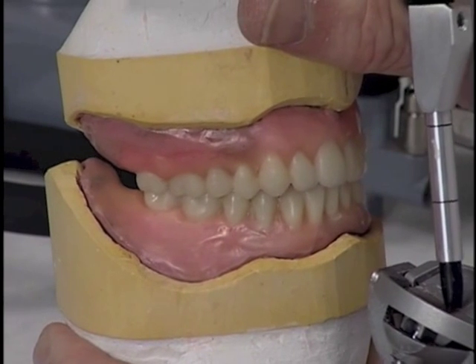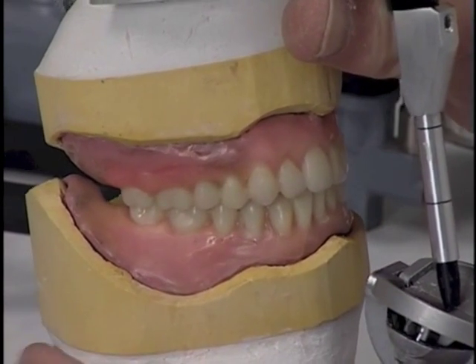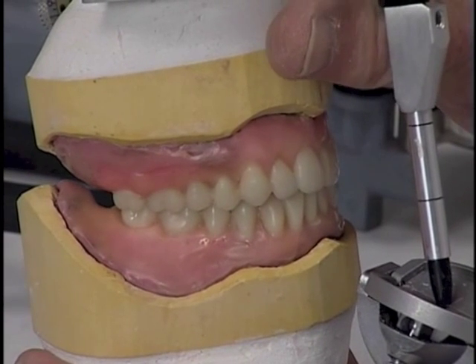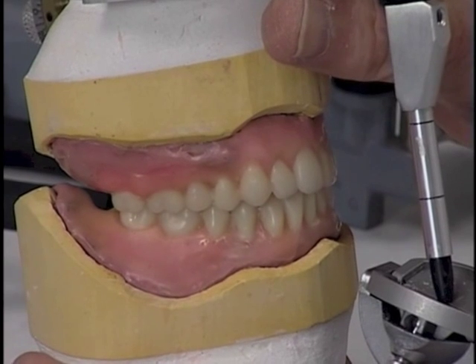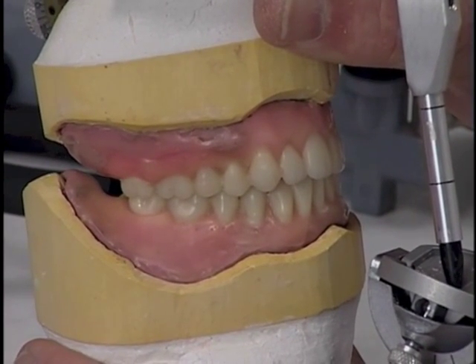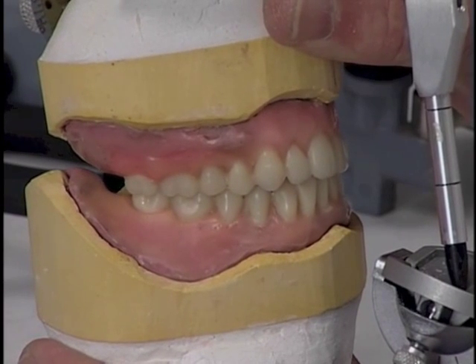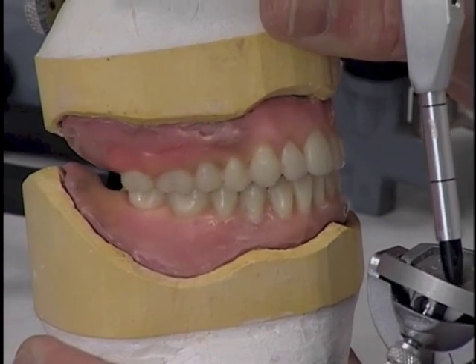Now this is set into an Angle's Class 1 classification of occlusion, in that if we look at the maxillary first molar, the mesial buccal cusp of the maxillary first molar aligns properly with the buccal groove of the mandibular first molar.